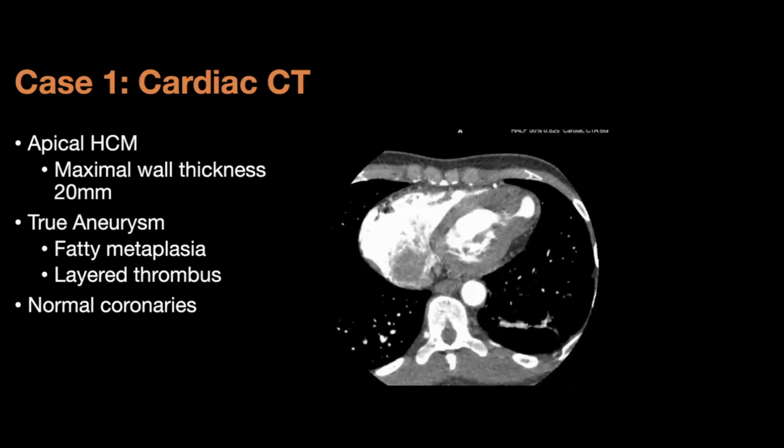I think this is a nice example of how we talk about aneurysms versus pseudoaneurysms. Exactly. Pseudoaneurysms usually are the ones with the narrow necks, whereas this has quite a narrow... No, no neck. Exactly. That was the concern. It involves all the layers, obviously, right? And that was kind of the concern that they had. They couldn't really get a good history from this guy, and they just wanted to make sure. And some patients with apical disease, apical hypertrophy without aneurysm, have chest pain. Right.